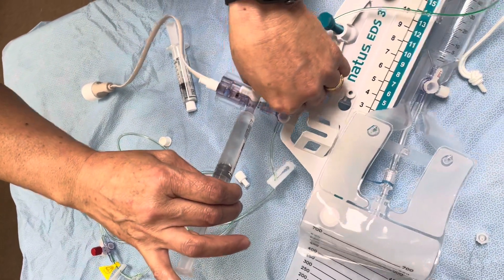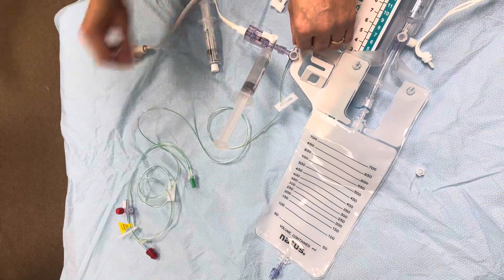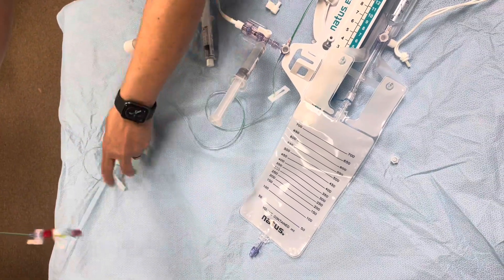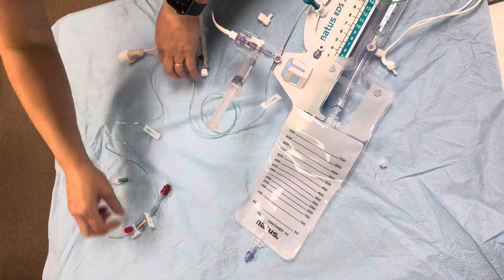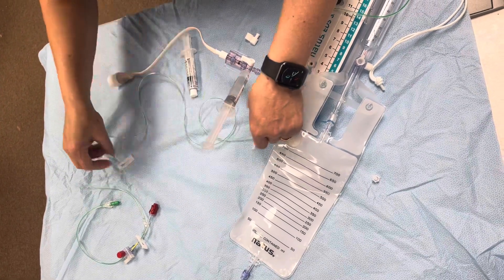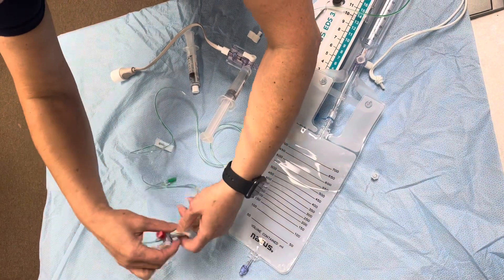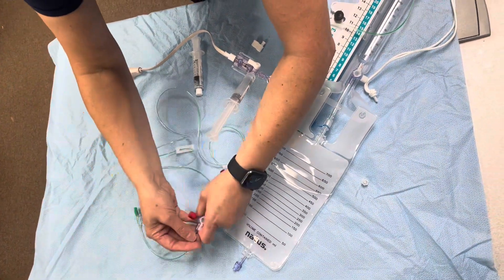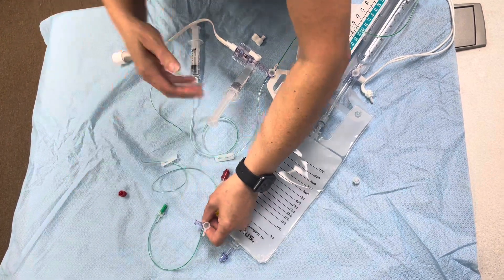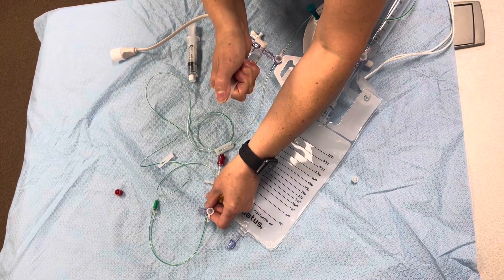I'm going to open it towards the patient — the catheter going towards the patient — and prime every piece of the catheter so you can see it flow through. As you see, there are three clamps; make sure those are all open. Open this piece as well so our saline flush can come out.